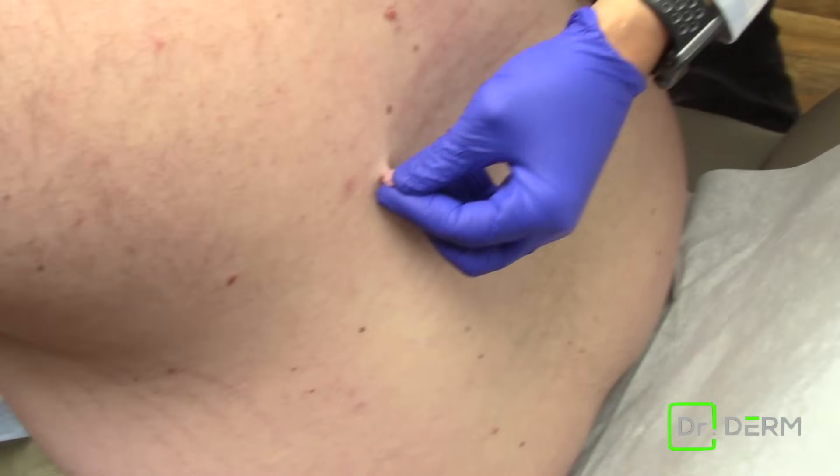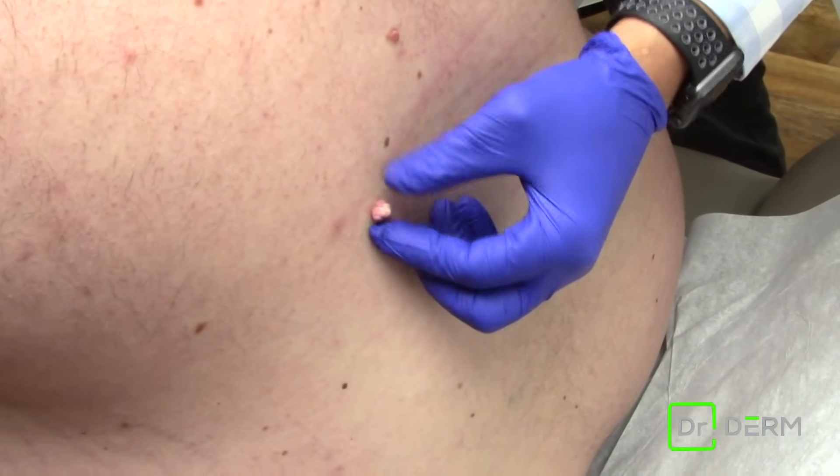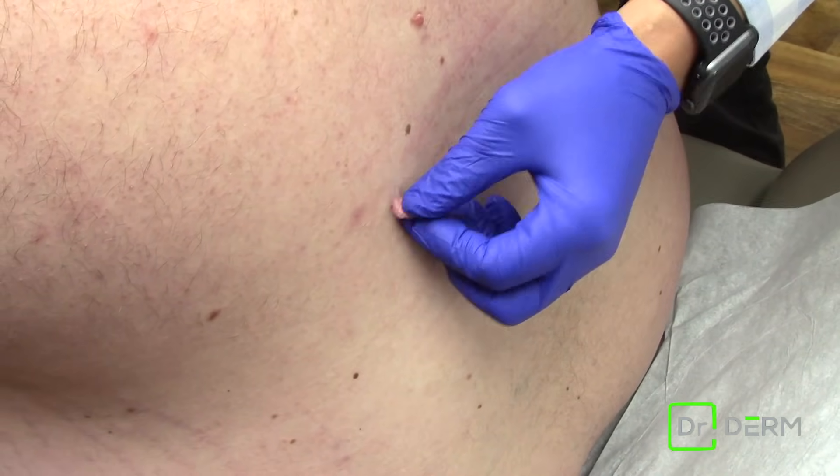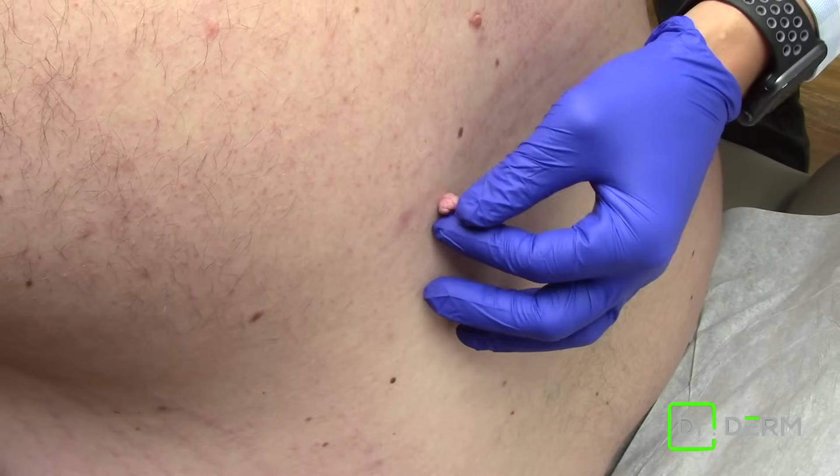Today we are taking off a skin tag off the back — it's a little bit large, pretty annoying. Skin tags are pretty typical like this where they have a bulbous outside.